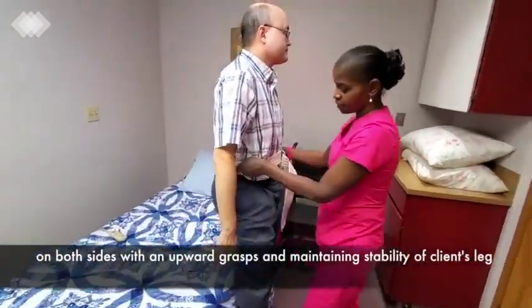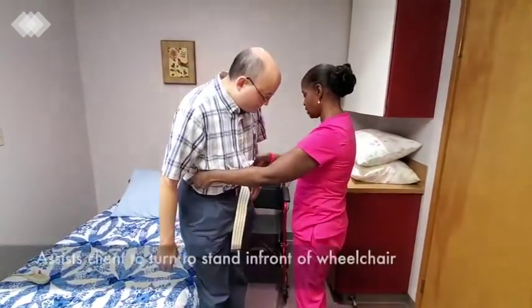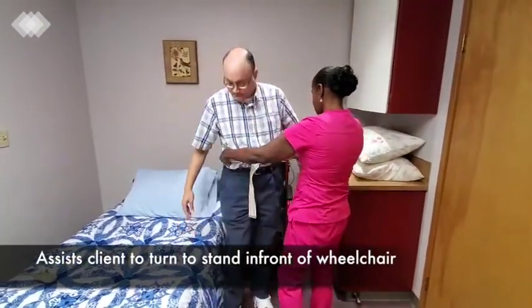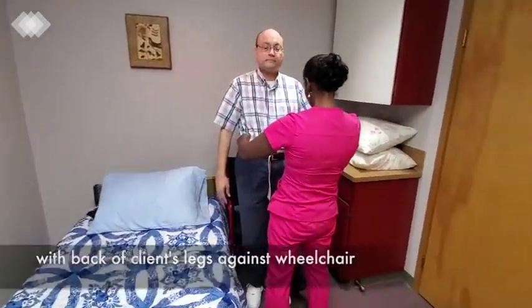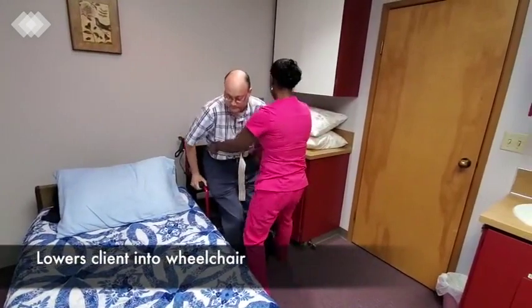Stand. Thank you. Now, can you scoot over to the wheelchair? The back of your knees should touch the wheelchair. And if they are, can you grab hold of the armrest and have a seat?